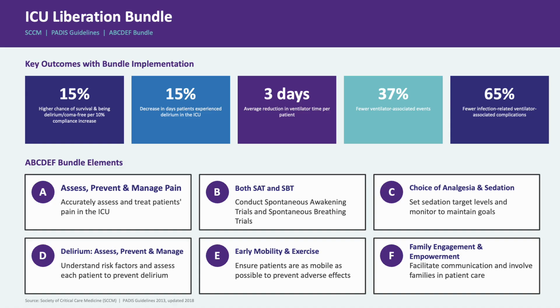These elements are not independent, they work together as a system. When you perform SAT and lighten sedation, that enables the SBT. When the SBT goes well, the patient can mobilize earlier. When they mobilize, delirium decreases. It's a virtuous cycle. And our protocols are being updated to reflect that interconnected approach. All right, let's move on to the assessment.